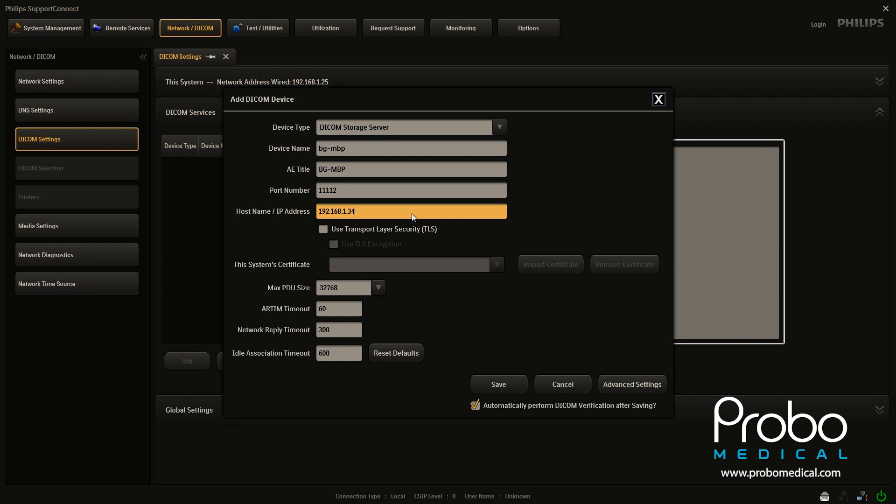The host name and IP address, this is of the server itself. This is not the machine. We've already entered the machine's IP address. This is for the server itself.